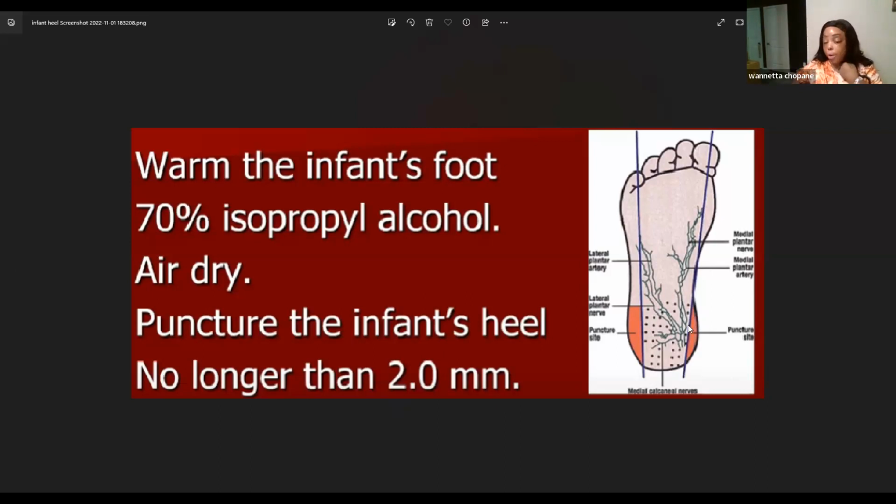You will see that again. So if I ask you, okay, are you comfortable? We're running clinic today. I got babies coming in. Today is baby day. And so we're going to be sticking their heels. Are you comfortable with sticking the infant heels? And if I ask you, okay, where are you sticking the infant heels? And you say on the side, in the middle, that's fine, that's feasible. But on your test or on your quiz, it's going to be medical terms and it's going to say lateral medial area, okay? And that's where you stick your baby on the heel, okay?